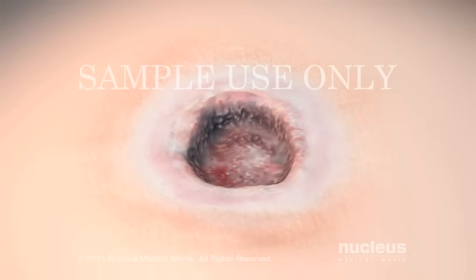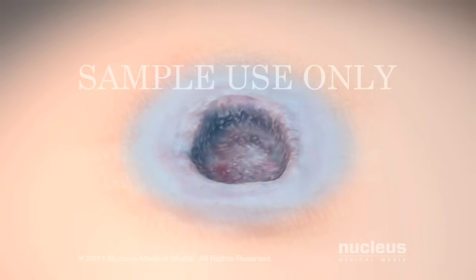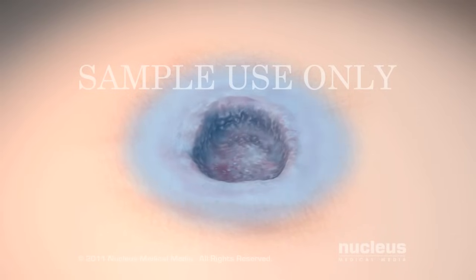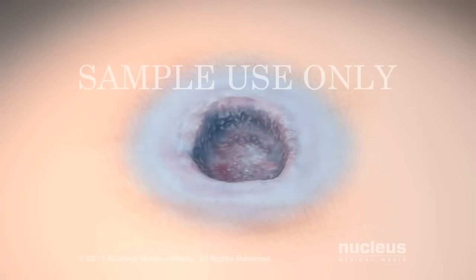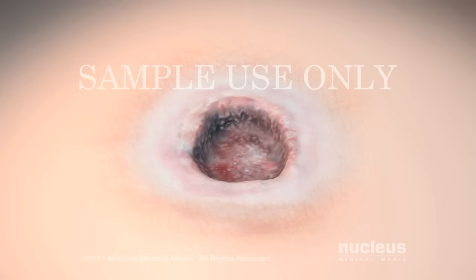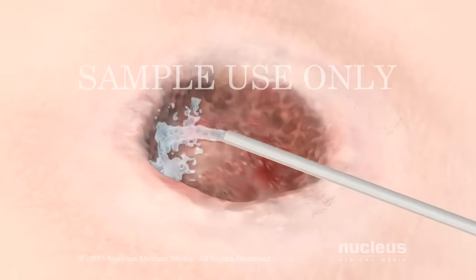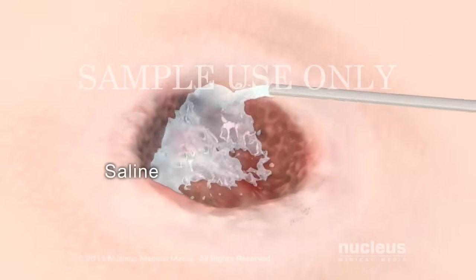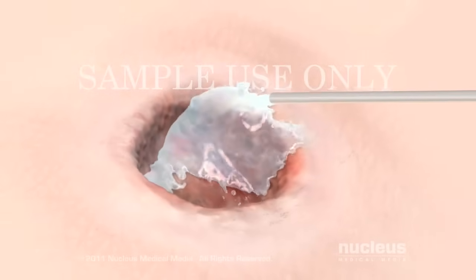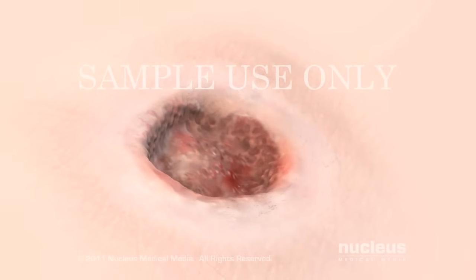Before your procedure, your doctor will numb the area around your wound with local anesthetic. For more extensive debridement, you will receive general anesthesia. To begin, your doctor may use saline or disinfectant solutions to wash or irrigate your wound.